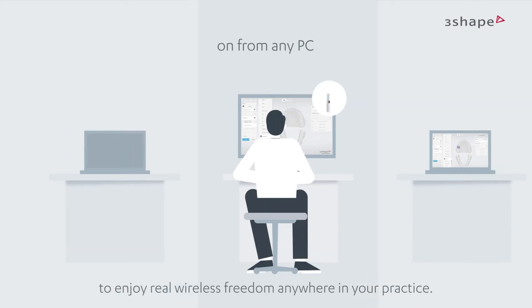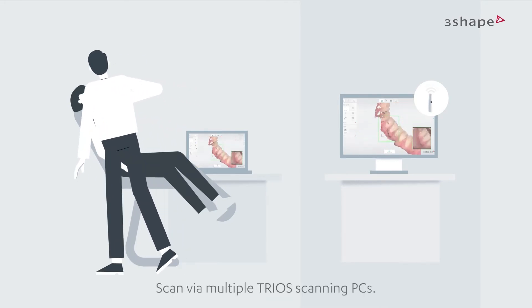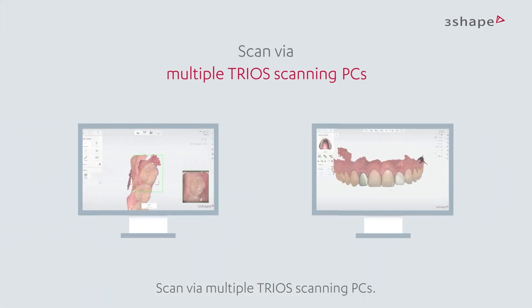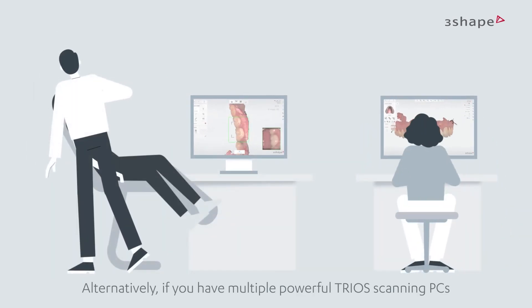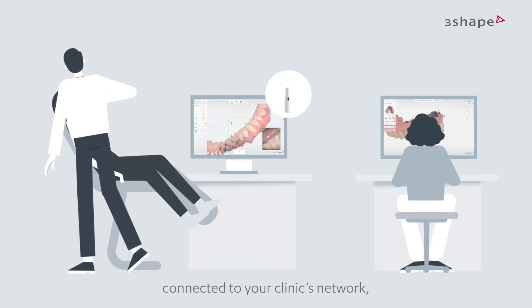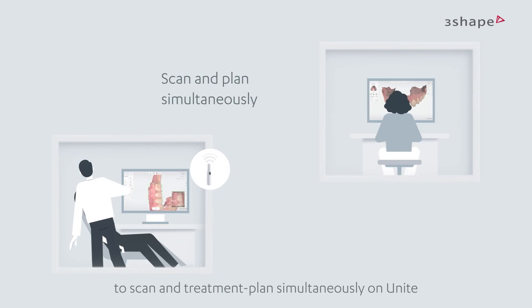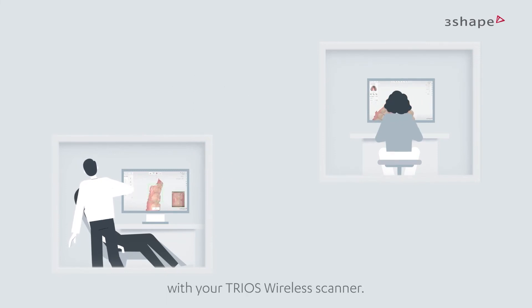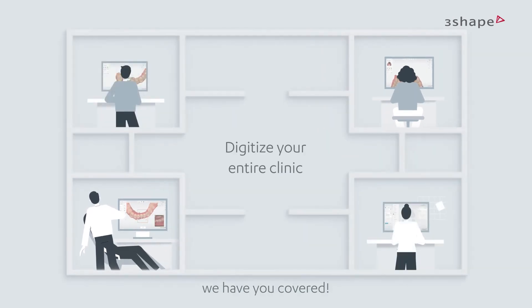Setup two: scan via multiple TRIOS scanning PCs. If you have multiple powerful TRIOS scanning PCs connected to your clinic's network, you can now use them all interchangeably to scan and treatment plan simultaneously on Unite with your TRIOS wireless scanner. No matter what setup option you choose, we have you covered.